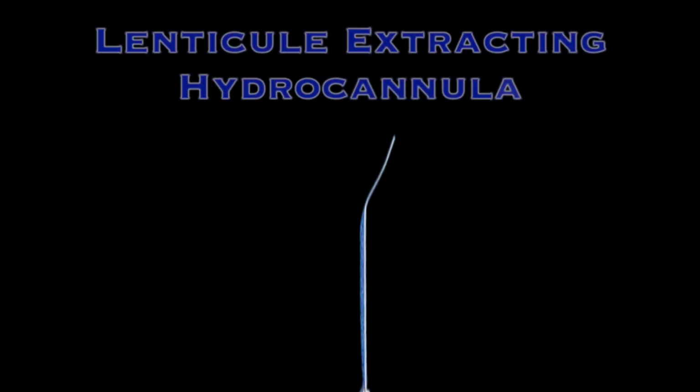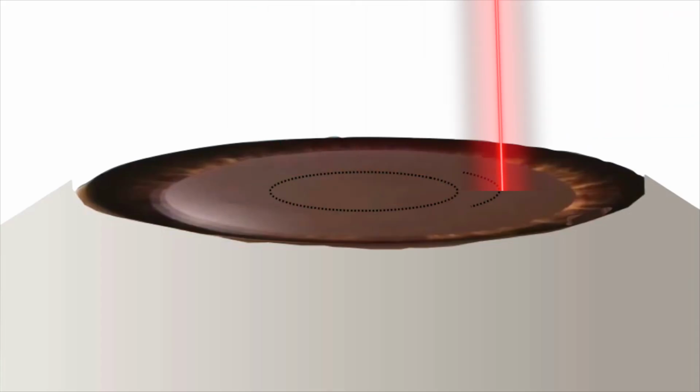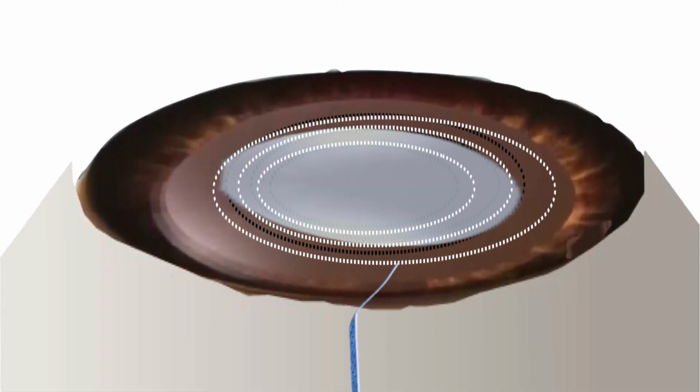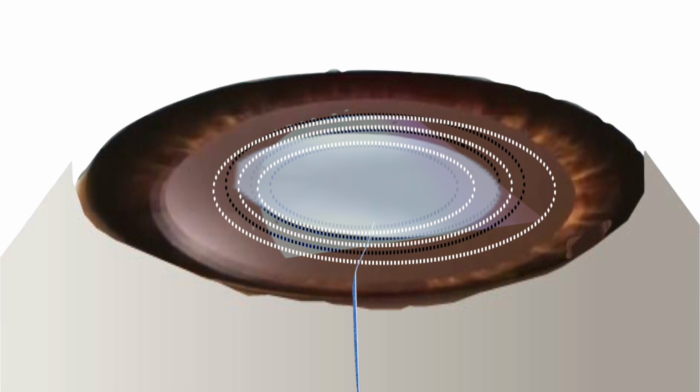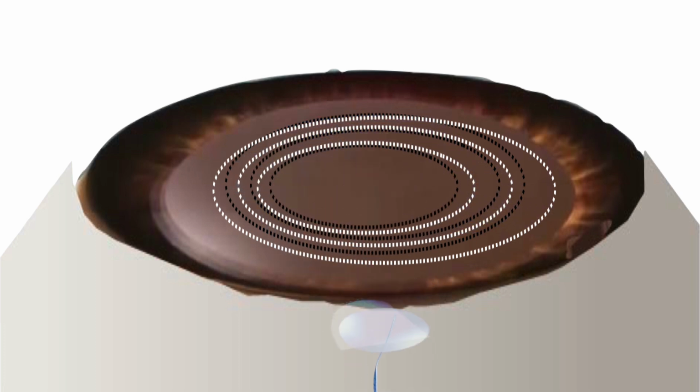The hydrocannula is of 23 gauge and it bends to facilitate its movement over the contour of the cornea. The curvature of the cornea was taken into consideration while designing the cannula, and we have been using it for over 12 months now. We have done successful extraction of the lenticules in 196 eyes over this period.